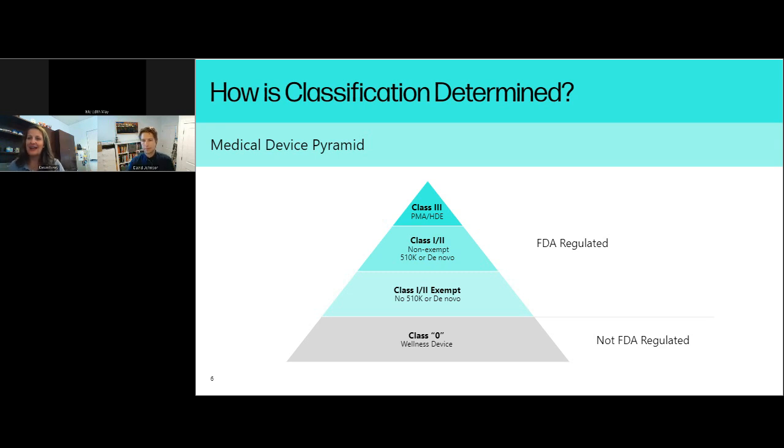And so at the time that the FDA is starting to wrap their head around, okay, what does this all mean? And what are the different input variables that will impact the performance of the finished device? And how are we going to correctly apply a risk assessment to each station in printing a device? And how are we going to quantify that? And what effort does that take? And so I always joke with people that when it's a new type of technology, there's always a bell curve associated with the FDA. So more questions, more inquiry, more requirements to provide information for a longer period of time until we've answered all those questions.